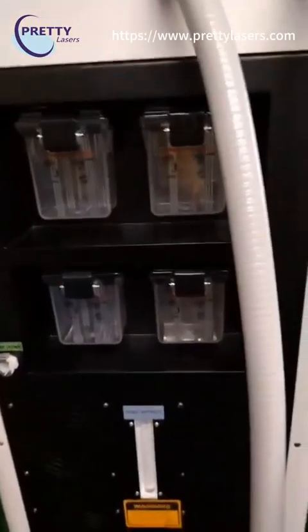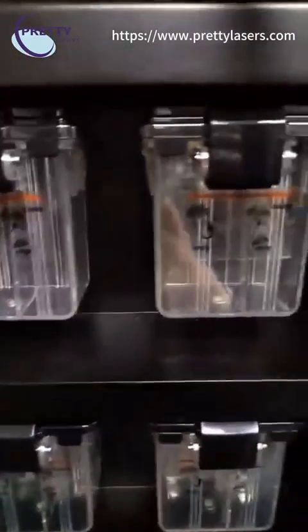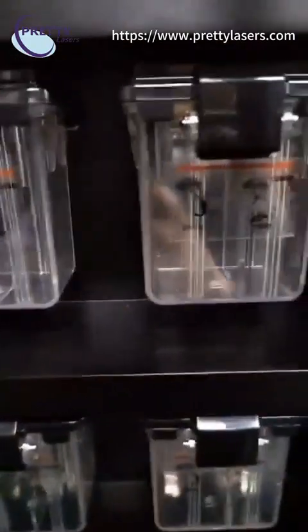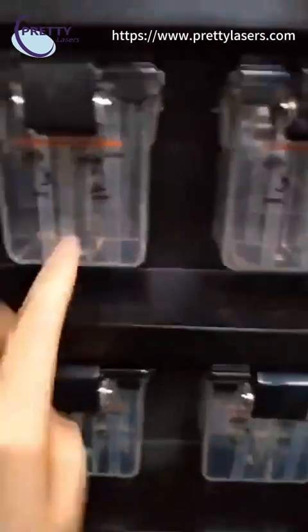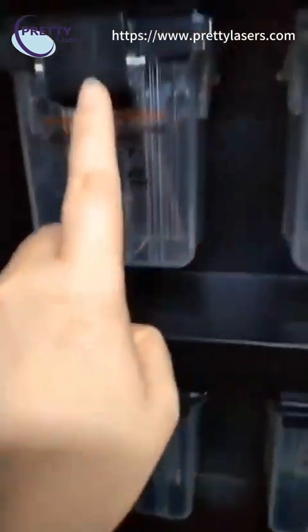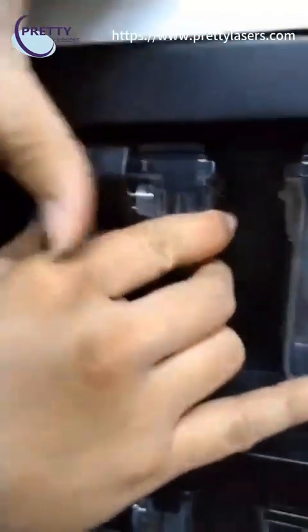This is the filter for this machine — four pieces in total. The waste liquid must not go over the red line. When the waste liquid is too much, press and take out the bottle, clean out the liquid, then install it back securely — you will hear a sound when it is properly installed.